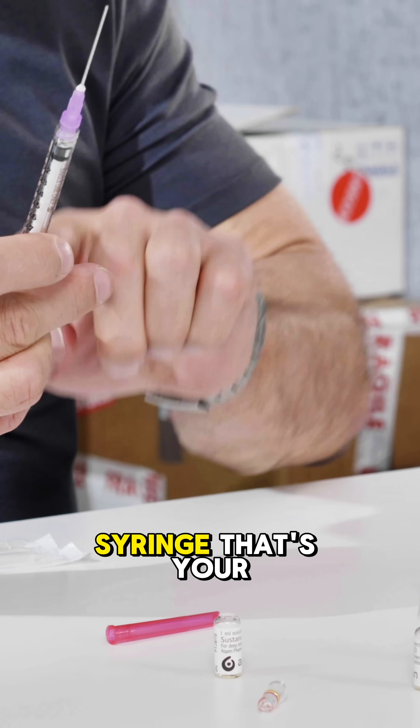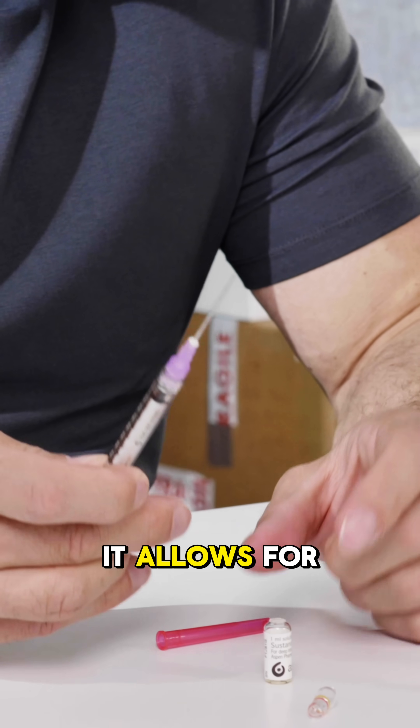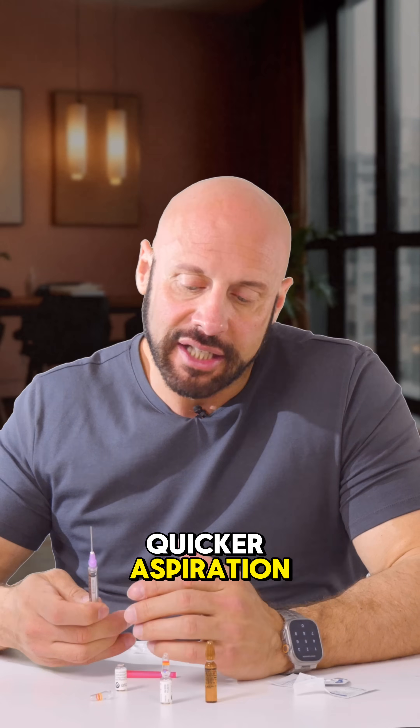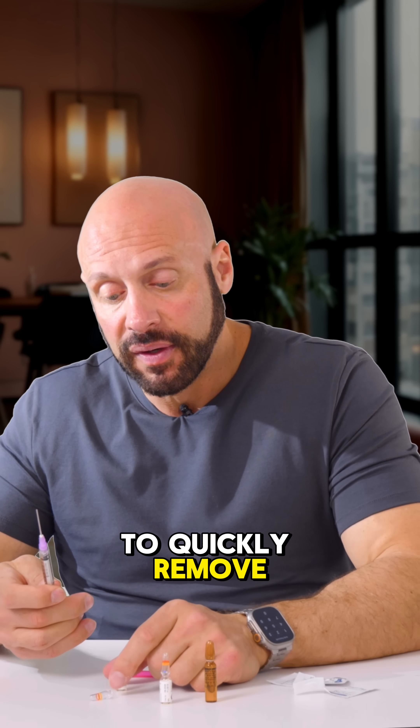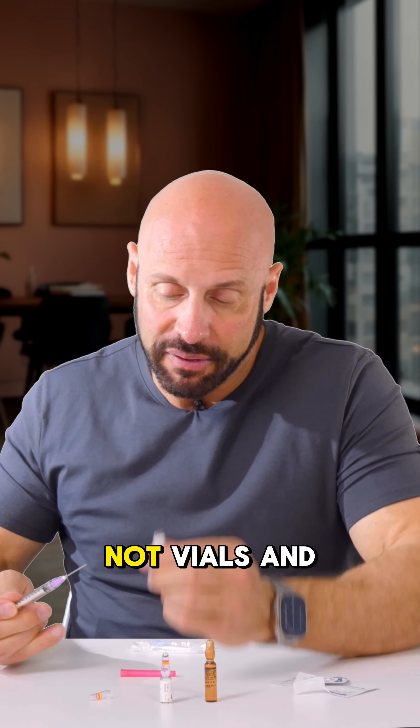This is the syringe and that's your filter needle. It's thick — 18-gauge — because it allows for quicker aspiration, or allows you to quickly remove the content of your ampoule. Again, these are called ampoules, not vials.